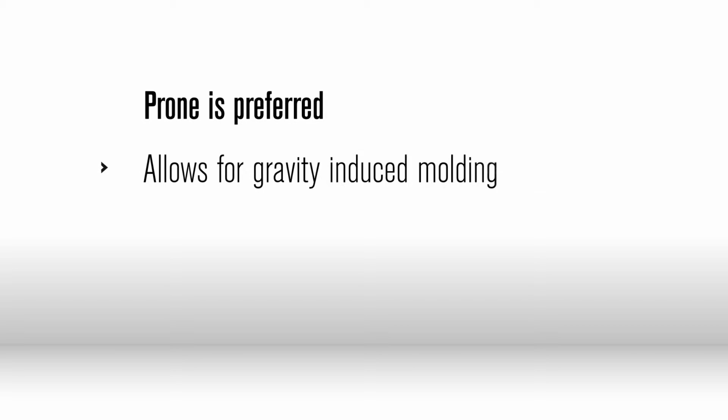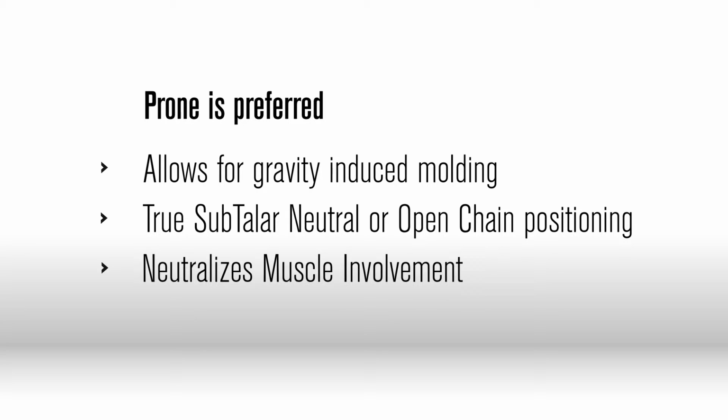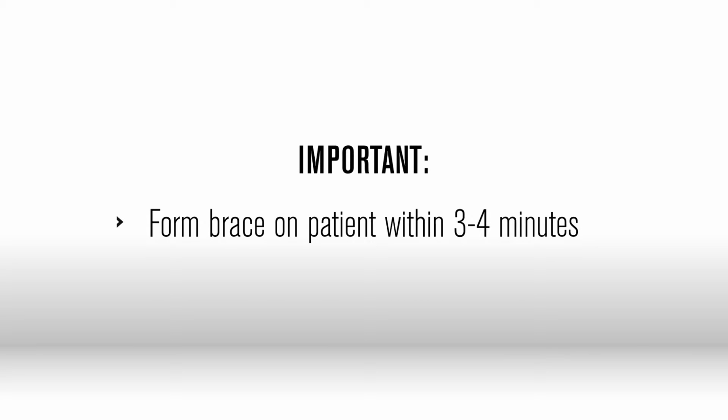Regardless of the type of correction needed for the patient, forming the brace on the patient when prone allows for gravity-induced molding, true subtalar neutral open chain positioning, and neutralizes patient muscle involvement. The Exos free motion brace cools quickly, so fitting and forming of the brace should be completed within the first 3 to 4 minutes after removing from the Exos oven.